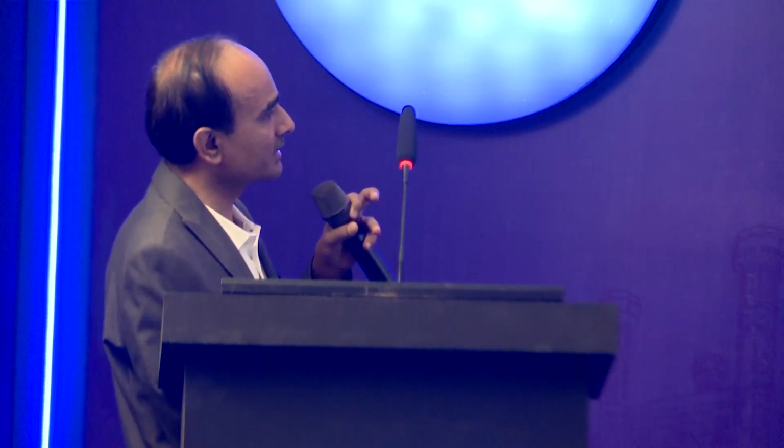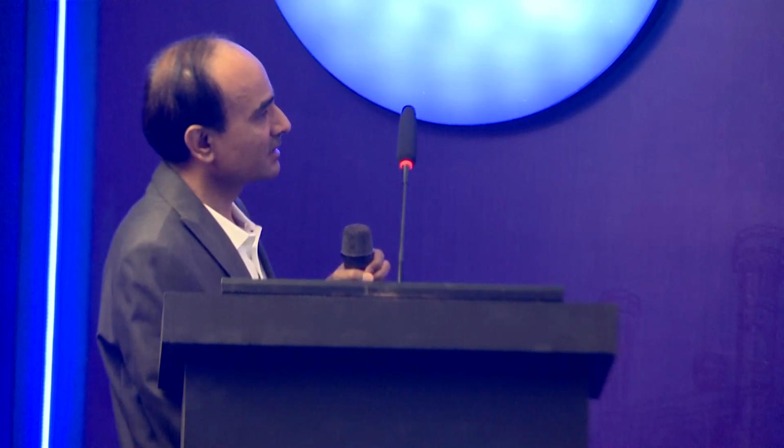And I tell you one thing, up till this time, the time which was taken to improve the slow flow was almost 2 times that of doing this one, because we kept on changing the strategies. So we did not take a lot of time for doing this one. So this balloon is going out.